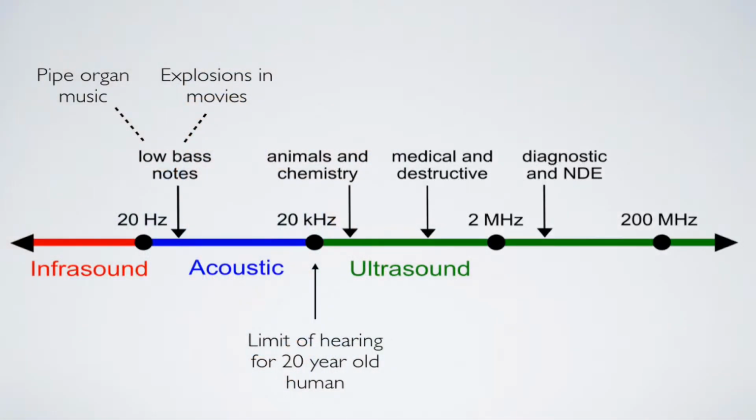So what's ultrasound? Well, ultrasound simply refers to sound waves that are above the human limit of hearing. So if you're about 20 years old, that is about 20 kilohertz. For the rest of us, it's quite a lot lower, probably down to 15 kilohertz once you're in your 30s and 40s. And this is sort of akin to the electromagnetic spectrum. This is just a sort of sound wave spectrum, if you like. And you can see there's what we hear as sound and noise in the middle. And then there's ultrasound just above that to the right in the diagram as you're looking at it.